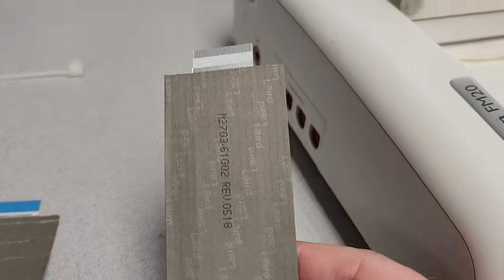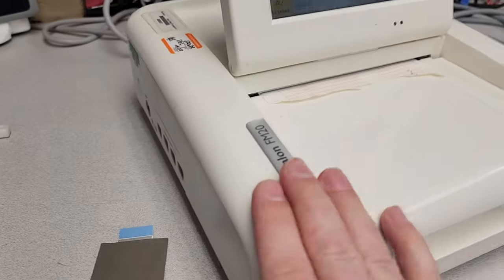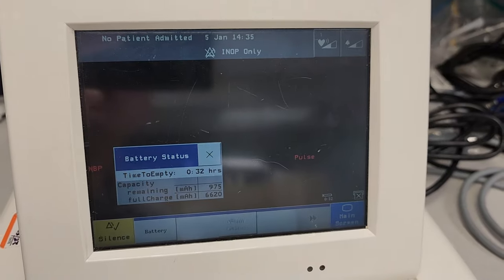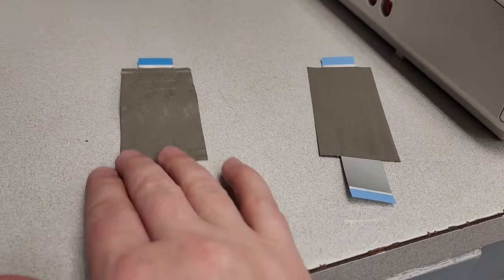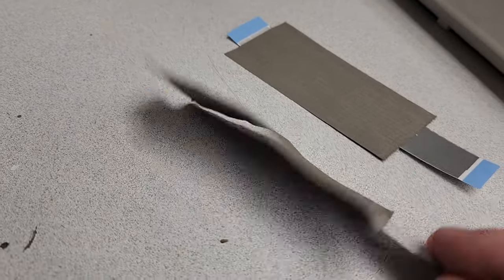And here's the replacement cable right here. It's very easy to change out, really. And while you're in there, might as well change out the internal battery. But you can see the unit is working absolutely fine. It was a quick thing, and I'm glad that these guys were able to get me the part before I had to fly back to Texas. But here we are, man.